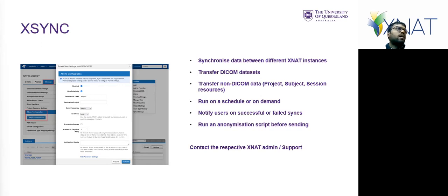We've actually used it for a project for a different XNAT where we created a project for some external sites to upload data, but we didn't want them to have access to the full project. So they have a bucket which they upload to, and then that syncs it onto the master project that contains the data for the whole project. So this is a common use case for multiple projects and using XSync to mix them together.